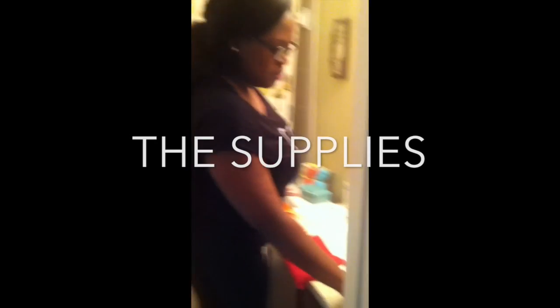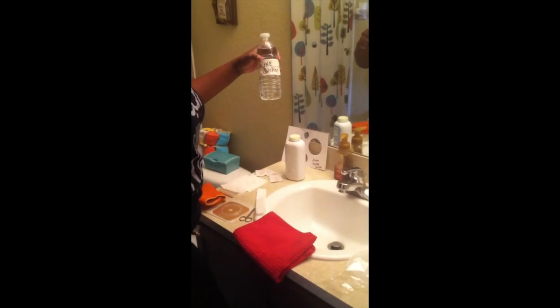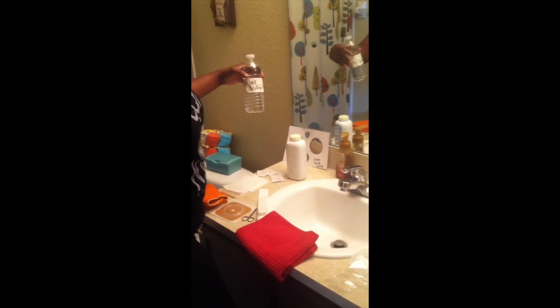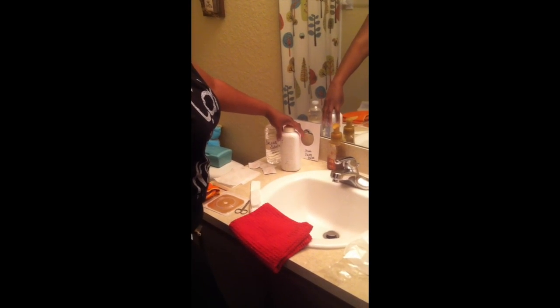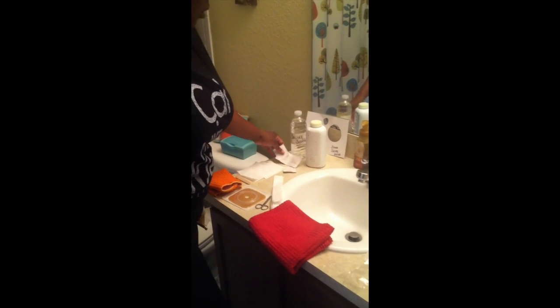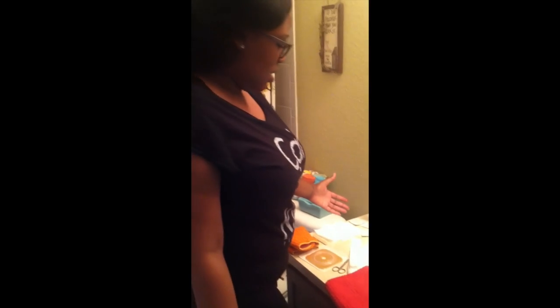These are my supplies. You want to make sure that you get your supplies out beforehand because as you're changing your bag you don't want to be fumbling through because your stoma is going to be leaking. I have a saline solution that I use to clean my stoma area and my skin. I have the stoma powder which I use on my skin as a barrier — it helps protect your skin from the actual adhesive. And these are the adhesive pads I use to remove the adhesive.